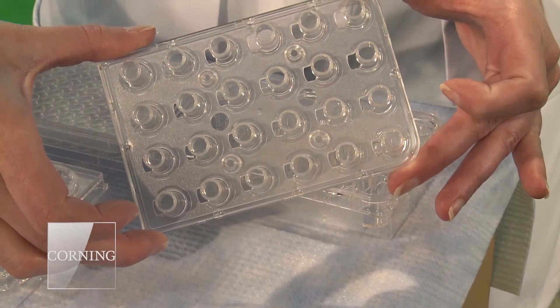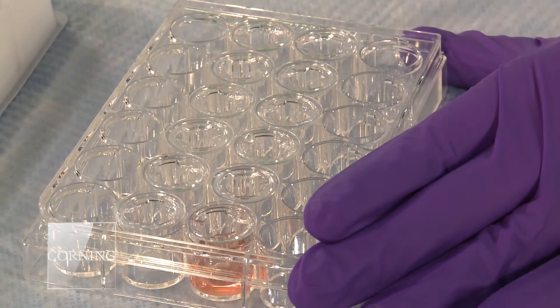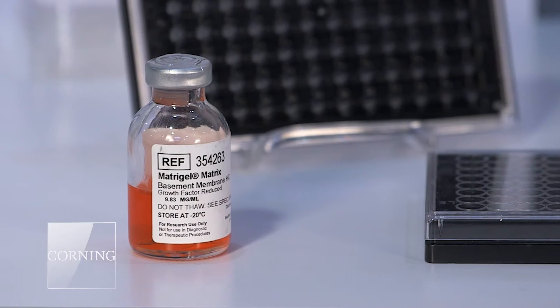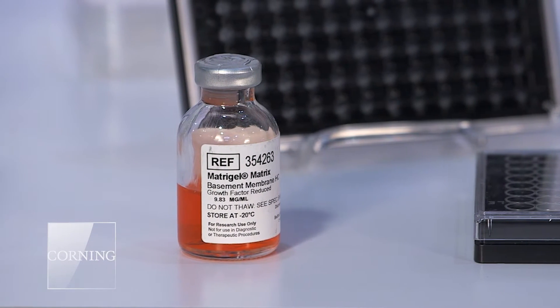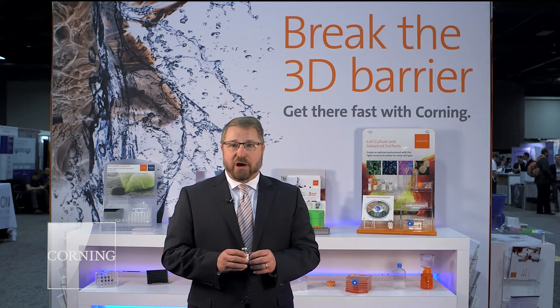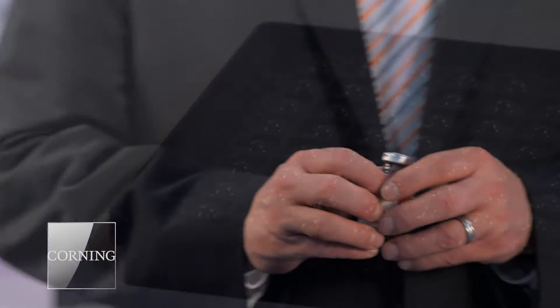3D cell culture is not new to Corning. We've been offering solutions to our customers in this arena for over 30 years with the launch of the Matrigel product now just over 30 years ago. This is an extracellular matrix product that allows customers to grow cells in a 3D environment in a simple cell culture system, whether it's a microplate, a flask, or a dish.